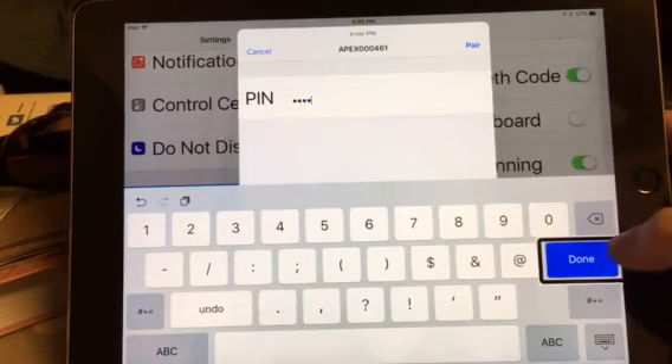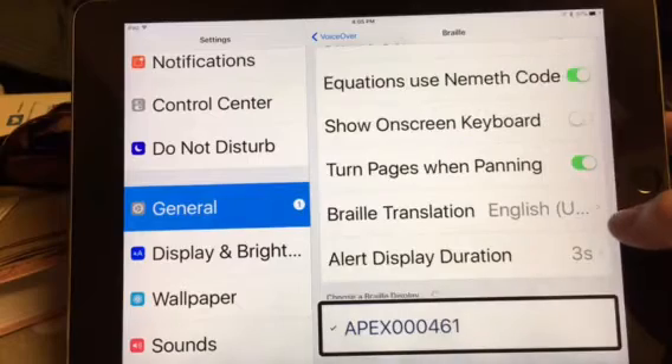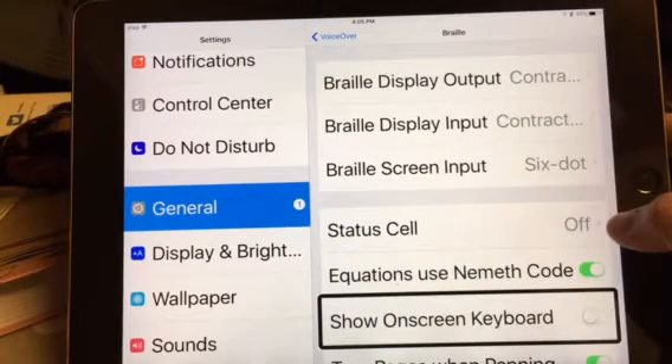Done. Selected. Settings. Apex 0, 0, 0, 4, 6, 1. Connected.